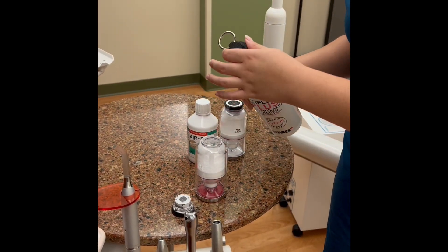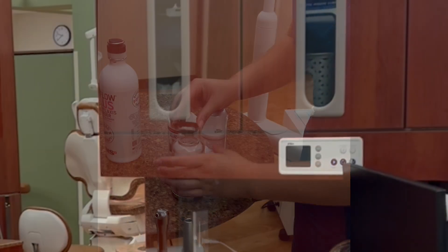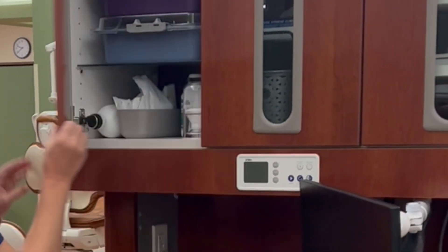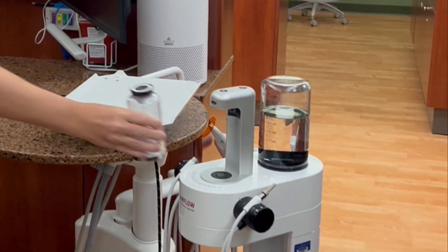Before refilling the powder in the canister, always ensure you are using the correct one to refill. Once you have chosen the correct powder for use on your patient, simply place it into the pressure chamber.